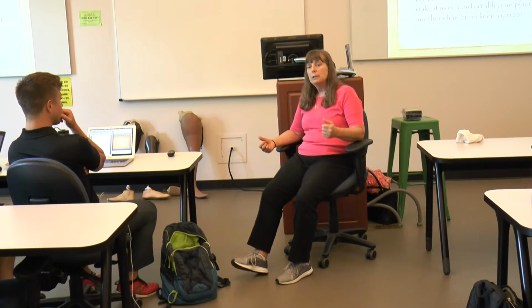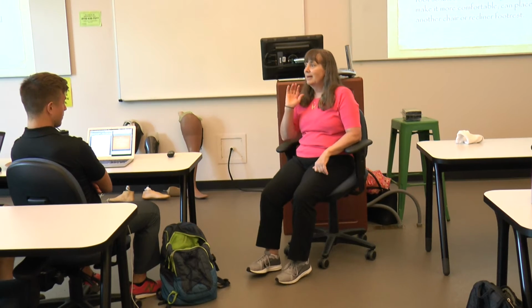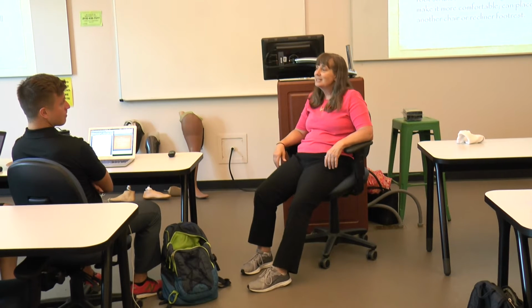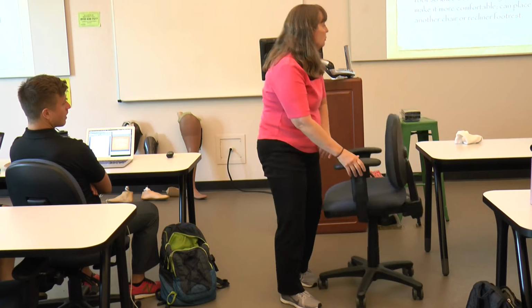If you do not want somebody pushing them while they're holding their foot up, now remember, I've got this prosthesis attached to me with a lanyard or wherever. Okay? I'm pushing and all of a sudden my foot hits the ground. What do you think is going to happen? They're going out of that chair if the person pushing them is still going, because they just hit the brakes. Worse than a skateboard hitting a rock. Boom. Okay, and it causes problems. So if they have a transfemoral amputation and they're in the wheelchair, they must have the footrest on the side of the prosthesis, in order to not get hurt with moving it.